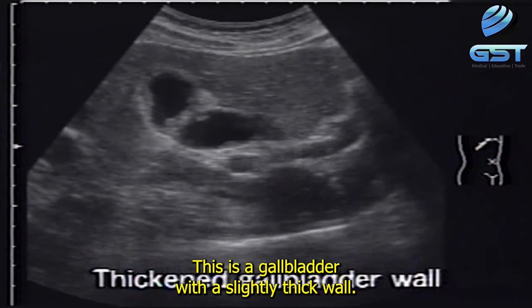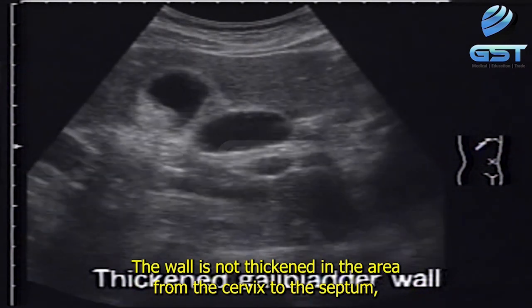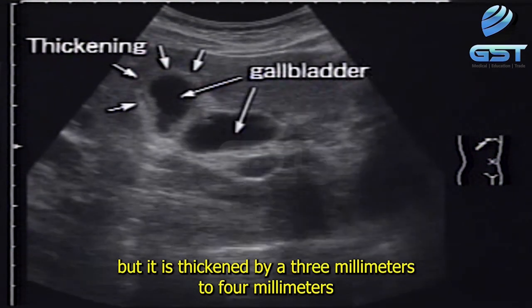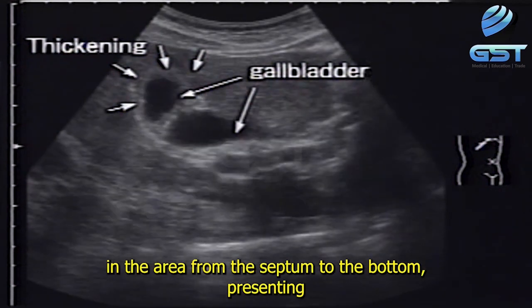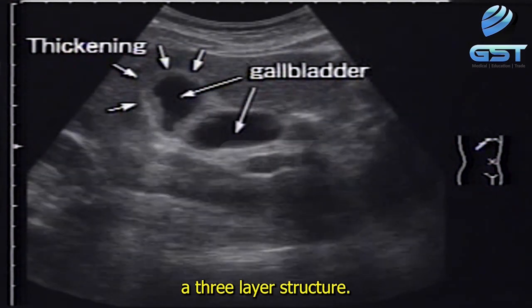This is a gallbladder with a slightly thick wall. The wall is not thickened in the area from the cervix to the septum, but it is thickened by 3 mm to 4 mm in the area from the septum to the bottom, presenting a 3-layer structure.